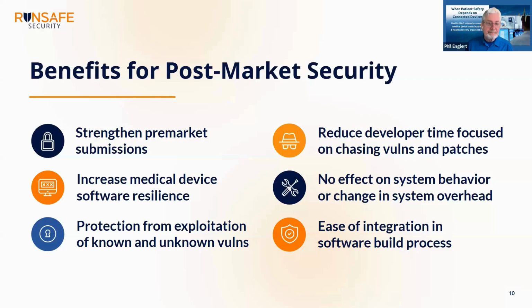Yeah, number one, and this is super directly relevant for medical devices, is really be focused on getting an accurate SBOM. Obviously, I'd love for RunSafe to be your provider, but if you can get an accurate SBOM from someone, that's going to help you. The value of that is huge. So getting something accurate, ideally at build time, and easily updated in your CI pipelines or software build processes. That's probably the number one thing. You can do so much with a good SBOM, and a bad SBOM is just going to drag you down.